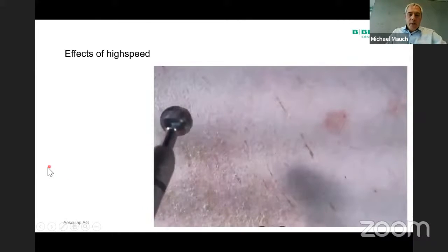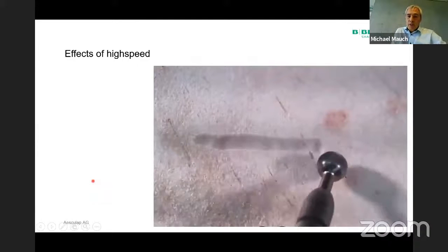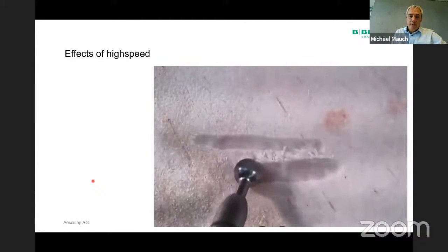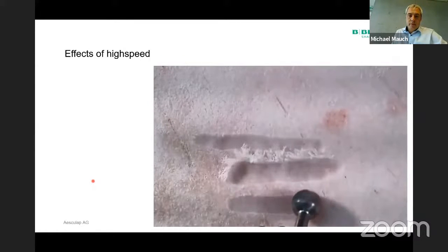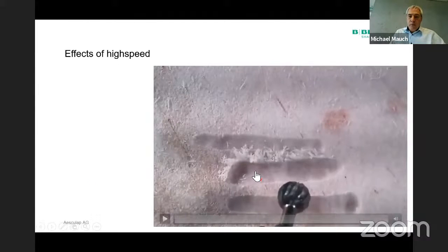Now, here you can see this in the video. If you don't hold the burr stably, you will just come out to the right. As you've seen above, the handpiece was not held stable, so it was just running away to the right. Now, if you go here from right to left, you create this little chattering, which you could maybe hear a bit, but you also see it here in the rougher surface of the bone. If you go from left to right, then you have less chattering and also a smoother surface.